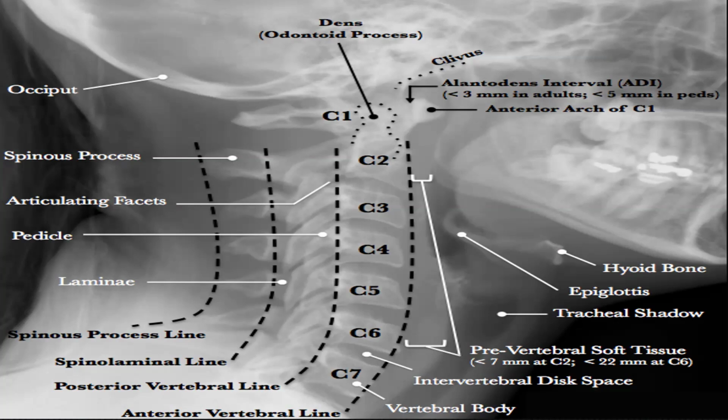Okay, sir. And when to do a CT scan? When the patient history is suggestive of a fracture or an injury, but we are not finding it on X-ray, then we can have a CT just to be concordant with the history. So if the Canadian spine rule is indicating imaging, and if the Canadian spine rule is not indicating, but the X-ray is normal, and the patient is showing any suspicion of fracture.